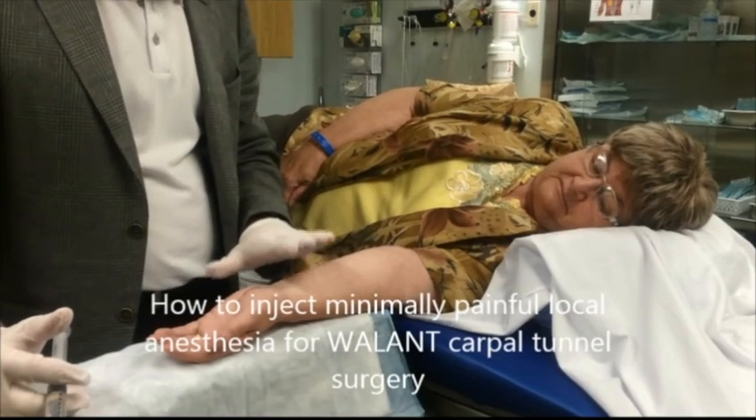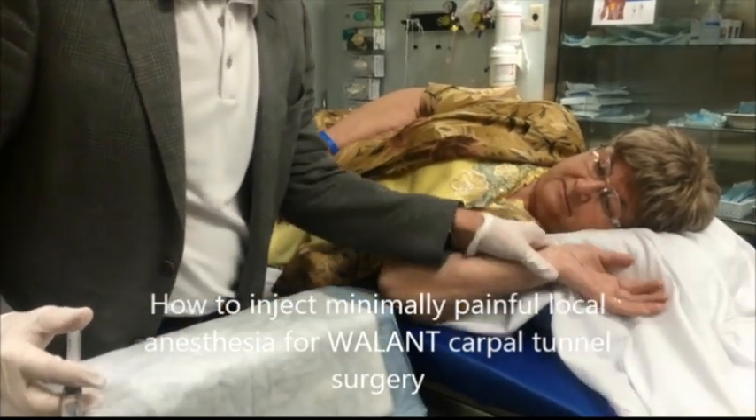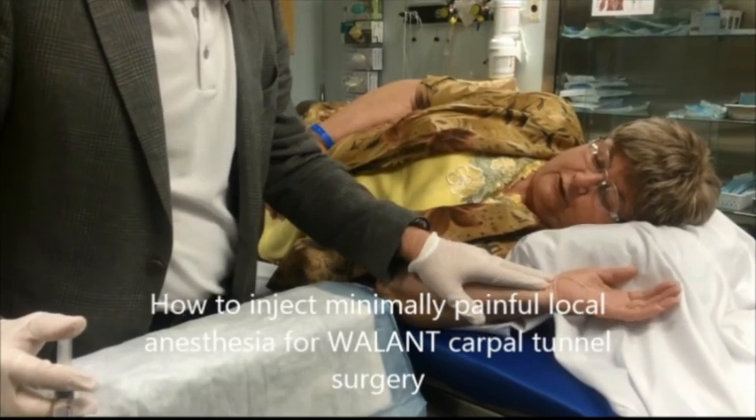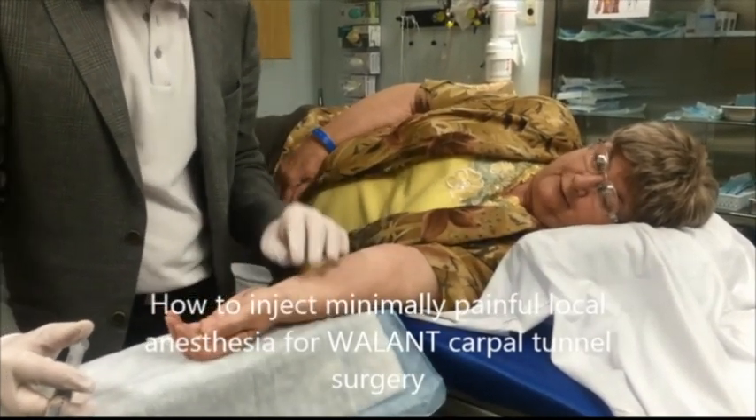So the first thing is, are you comfortable like that on your side? Would you be more comfortable if we had your hand up here? No, because I can't watch you. Oh, you want to see what we're doing. Okay, all right, no problem.